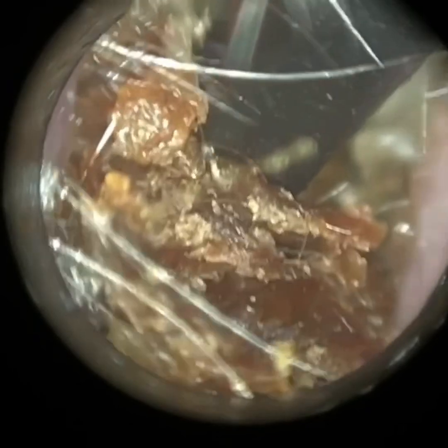Again, I'm just going to dilate open the ear. I'm going to use the corette again because it worked quite well in the other ear. Because of the tapered tip of the corette, I'm able to leverage that into the core of the plug and bring it forwards. But again, some parts of this plug are quite soft, and I'm just a bit worried that I'm going to smear it against the floor of the ear canal. So I'm pretty sure in a moment I'm going to use the suction to lift this off the floor. But before I did, I've got another sizable piece out.